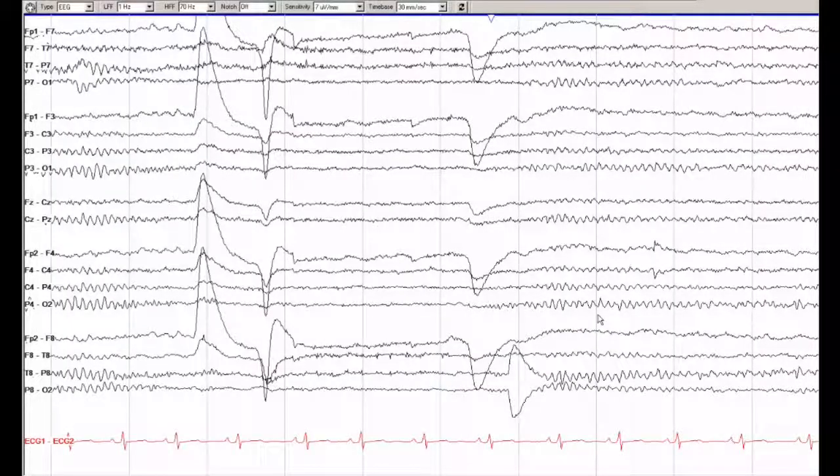After looking at the frequency of the alpha rhythm, we can explore its amplitude. As I have discussed in previous videos, there are no absolutes in EEG, as we are always comparing the signal at one position to the signal at another. Therefore, we can never get a completely accurate sense of the amplitude.